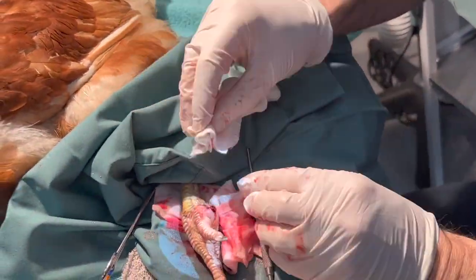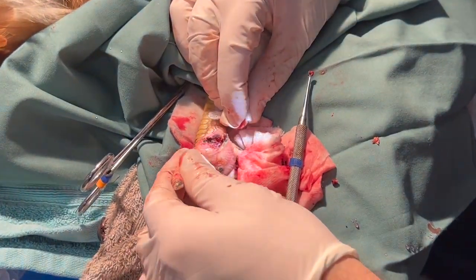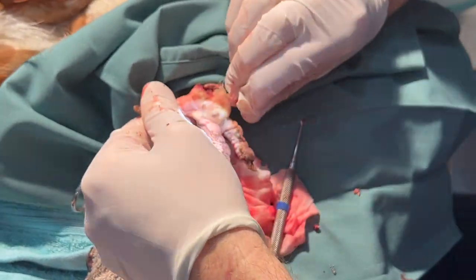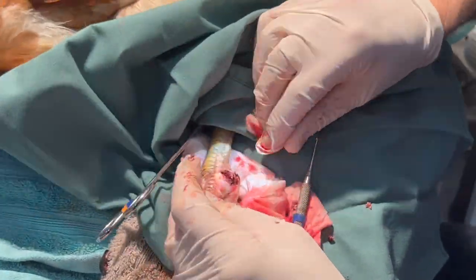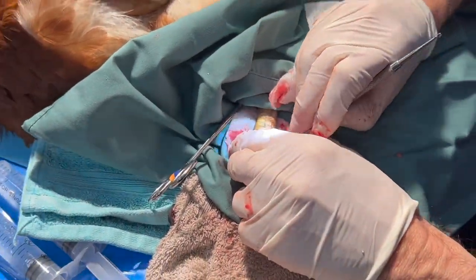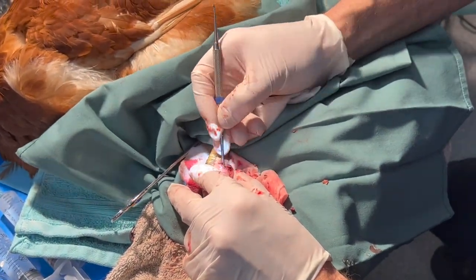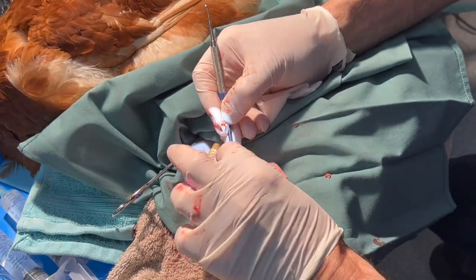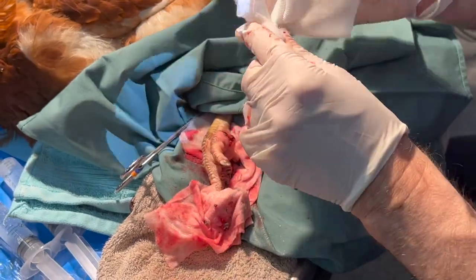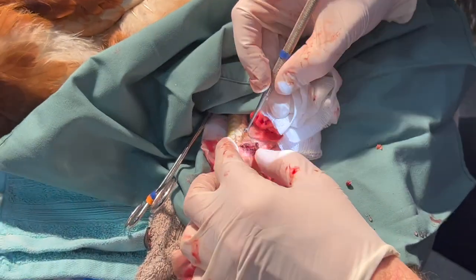We need to make sure the other scab at the base is dealt with too, though it's superficial. I'll go for another minute or two to take out any remaining tissue — I'm really just going on color and vascularity. I'm using something called a curette — a small instrument with two little cups on it like a micro teaspoon, smooth on the ends, so I can scrape out material without causing too much bleeding.